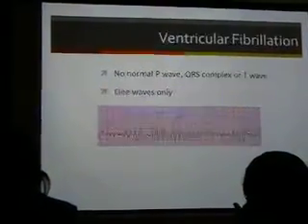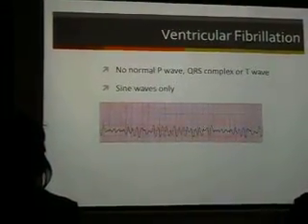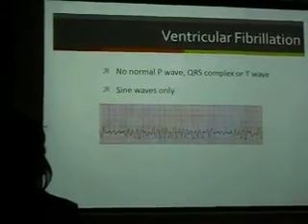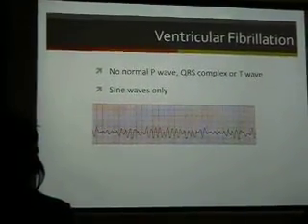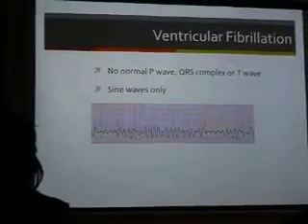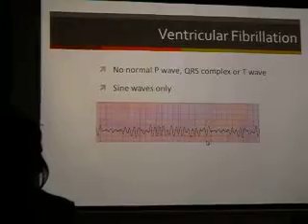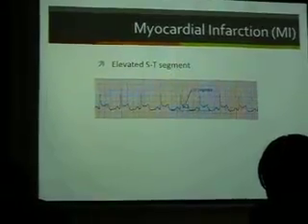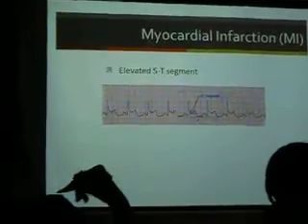So what would cause this? It could be that you had death of heart muscle, so that the electrical signals are not being transmitted through the heart like they should, in which case, even if you shocked them, you're probably not going to get a normal rhythm. Would an electrical shock cause something like this? If you were doing electrical work and you got shocked, if you had damage to the heart that was ongoing, you might see something like this. All right, here's that myocardial infarction with the elevated ST segment. See it here? So here's P, QRS, here's T, but this is higher than it should be. Normally it's down on about the same line.